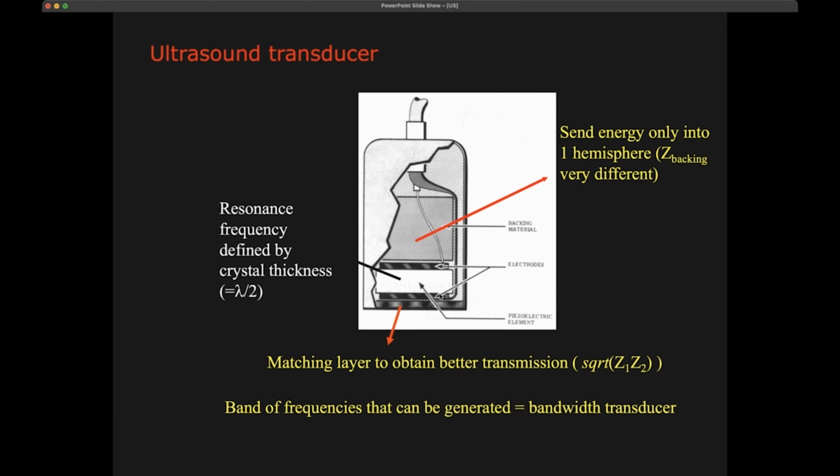And then one of the things that you will see is that, in order to get proper, efficient transfer of the energy towards the body that we want to image, what we need is a matching layer. We will see this matching layer actually has to match the acoustic properties of the piezo crystal with the object that we are imaging. That is based on the acoustical impedances, which we will explain in a minute.